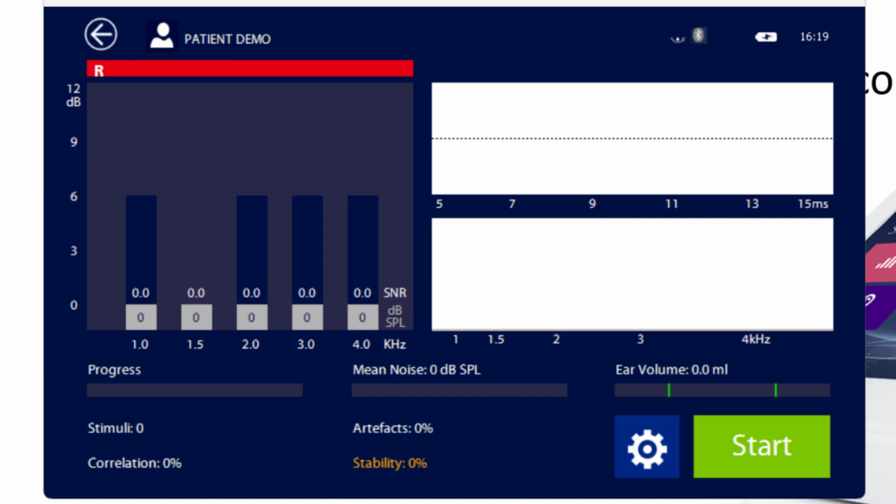It's because it's updating 3 different graphs, and at the same time it's communicating with the PC, and we've not optimized our software to manage all those tasks at the same time. If you demo TOAE from this software when it's connected, because of a latency problem in the communication, the measurement will not stop when you tell it to stop.